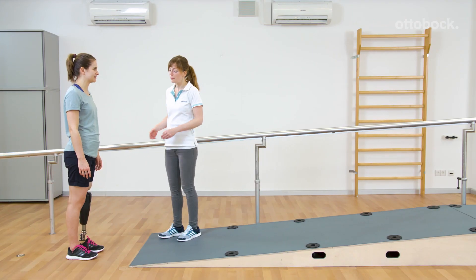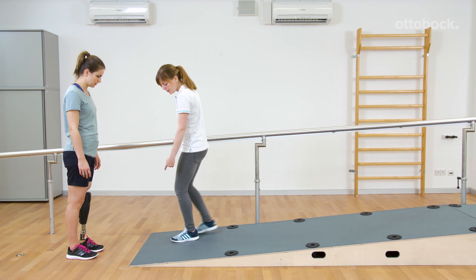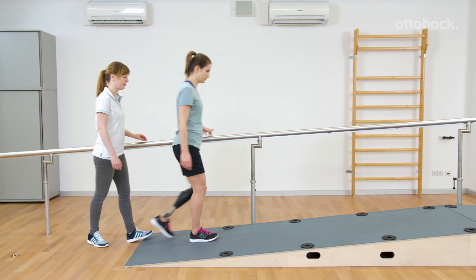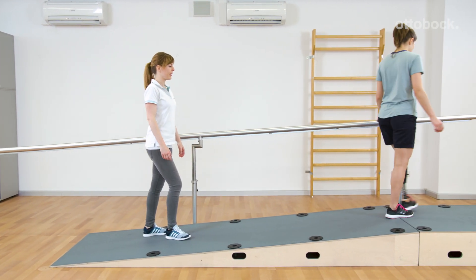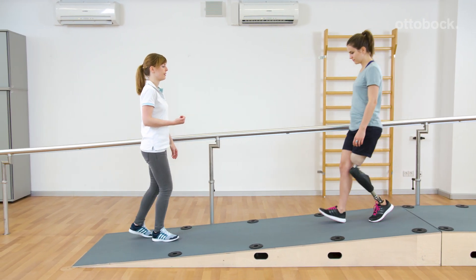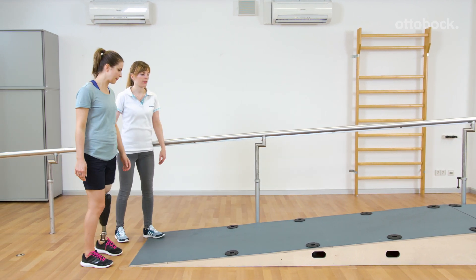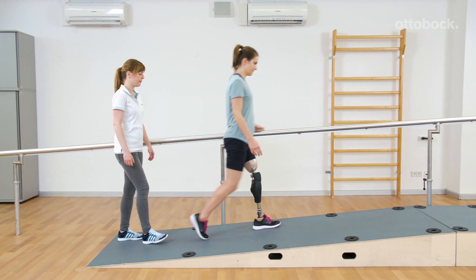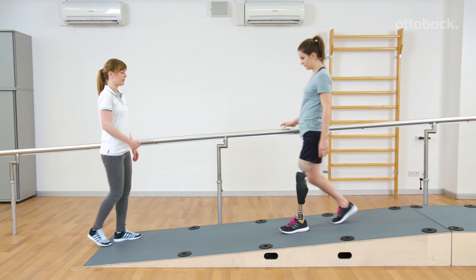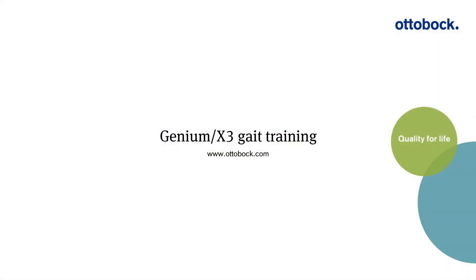When walking downhill on steeper slopes, stance release is not possible. Instead, Reka uses the yielding technique to walk over the flexed knee joint. Genium bends against the stance flexion resistance. With an upright body position, the center of mass stays constant over the foot. At the end of a yielding step, Genium allows stance release. Reka achieves more toe clearance when swinging the leg forward. Further information on yielding: please see the video on MPK training, yielding technique, and walking technique on steeper slopes.